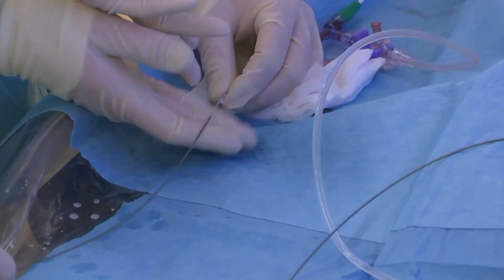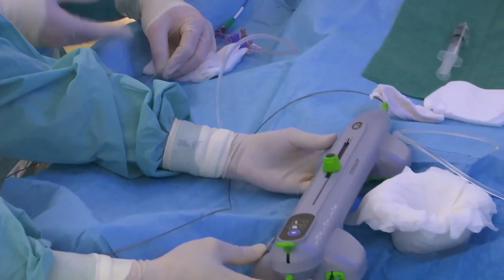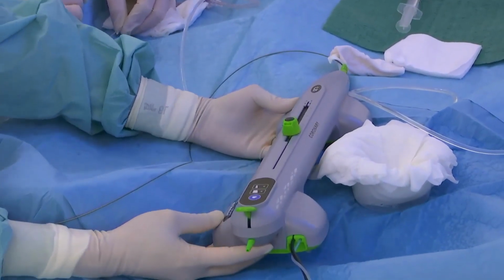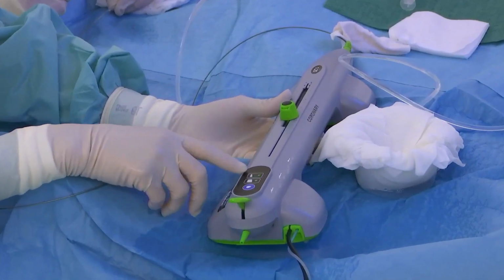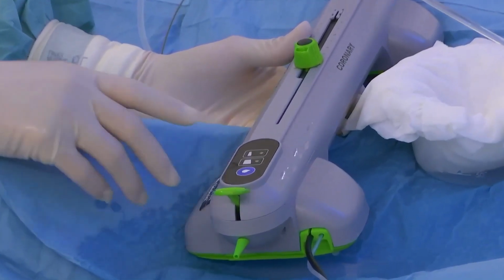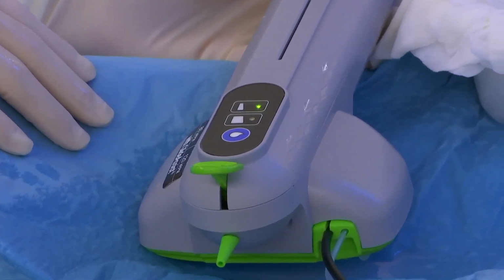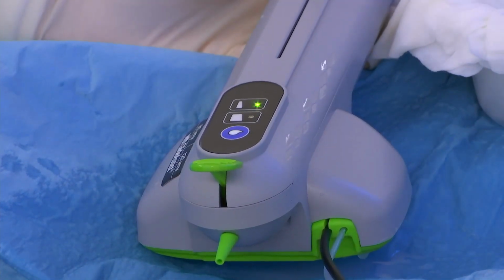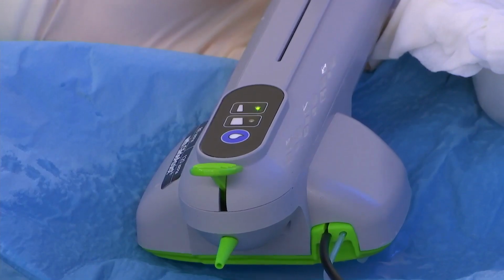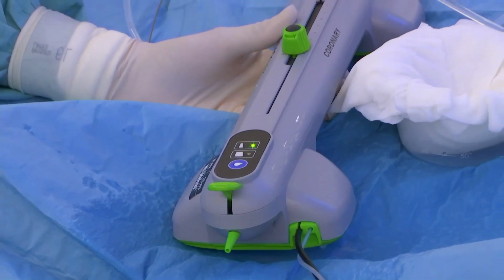You can see here is the 1.25 crown, and this is the device. So here is how it comes from the fabric, and then you have two buttons. One is for your speed, so you have a low speed or a high speed. They say that in most cases the low speed is good enough, because if you go slow enough, the orbit will be big enough to treat the whole vessel.